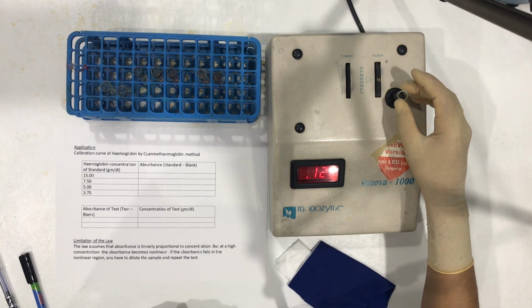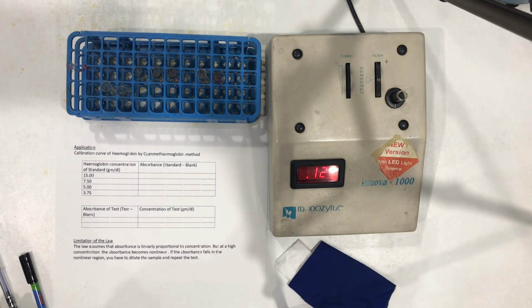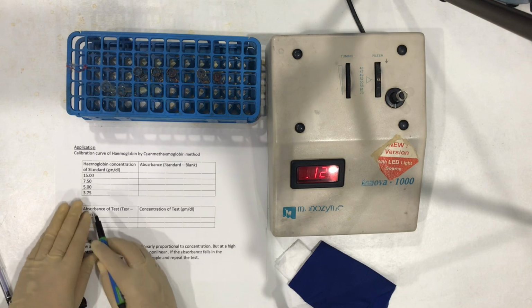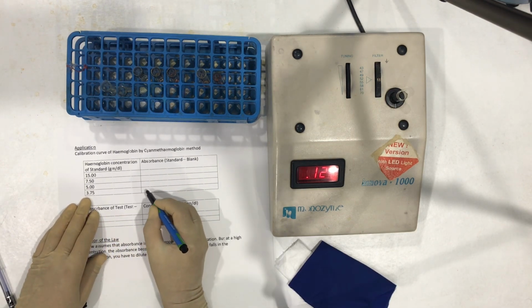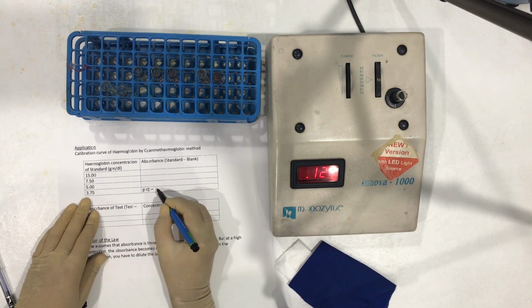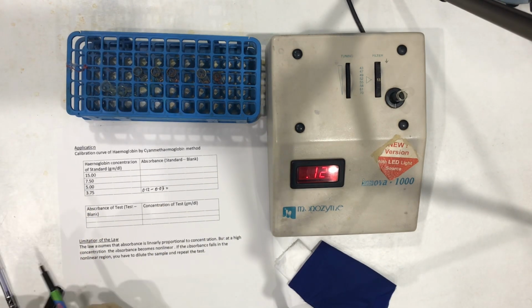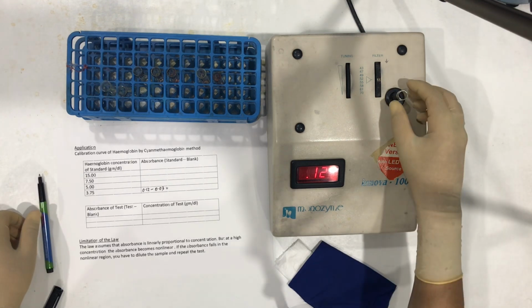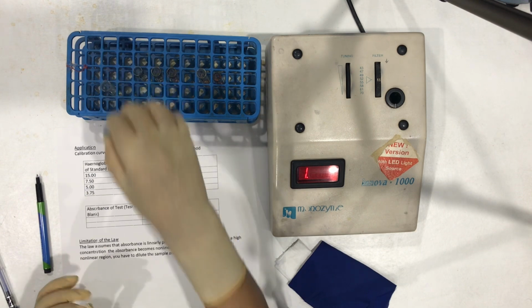0.12. So standard 3.75 is giving absorbance of 0.12 minus our blank 0.03. Let us take the absorbance of our second standard.